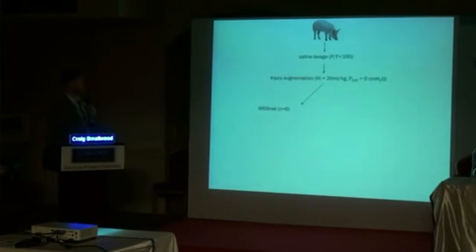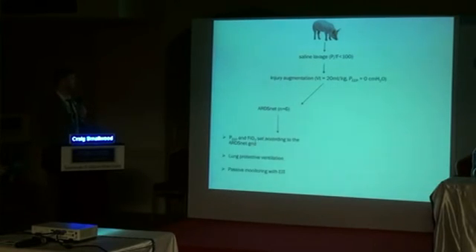What we did was we had to basically induce acute respiratory distress syndrome, and the way that we did that was saline lavage, which just washes out all the surfactant, which makes the lungs incredibly stiff. And then we augmented that injury with 20 mLs per kilo with a 0 of positive end expiratory pressure for a period of time. So we're just getting rid of all the surfactant.